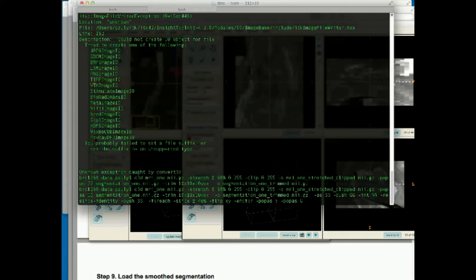We want to present to the OLI command the images in the right order. Well, no, in this case, actually, I don't think it was necessary. So we are popping and pushing it right back. So that might be unnecessary. I'll have to go see if there's a bug in this. If you guys are going to run it, hopefully it will run as it is.